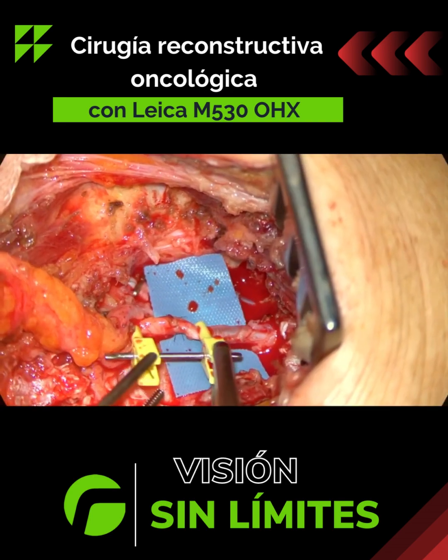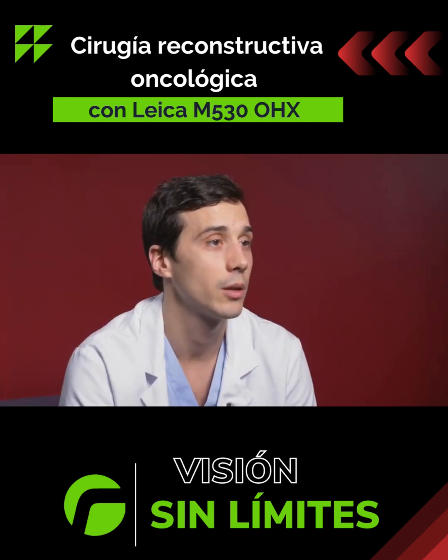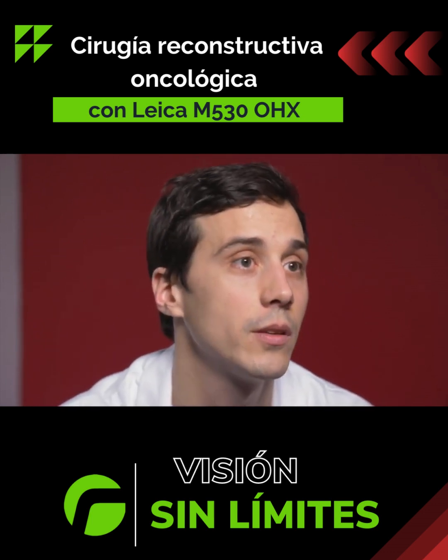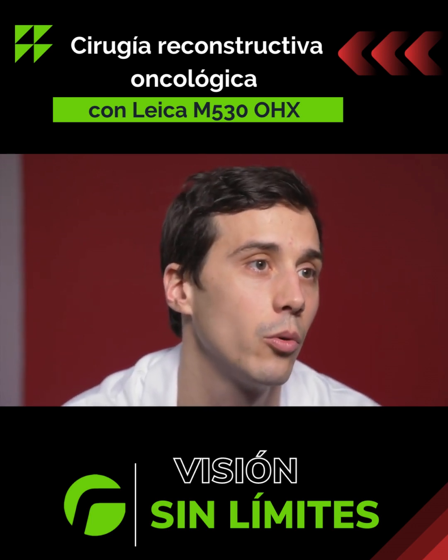The focal length helps me, whatever the distance and height of the table, adapt accordingly and obtain a clear image. Whereas when you have glasses, you have to adapt the whole table or stoop, which can be painful for the surgeon, especially when the operation lasts a long time.